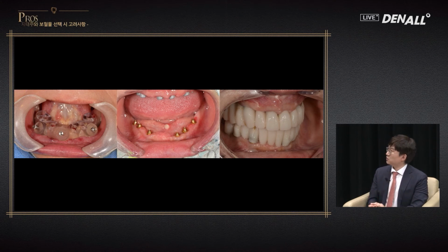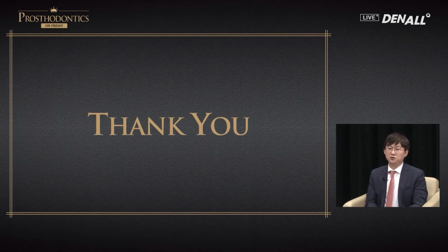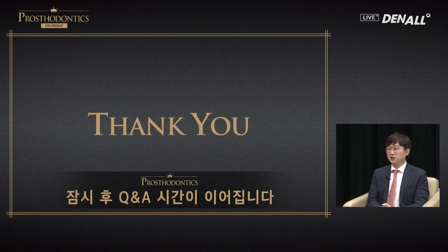I didn't do the scanning. There's an existing denture and the impression is taken with the denture. So a cementless approach is better for ease of removal later. So this is the prepared content.